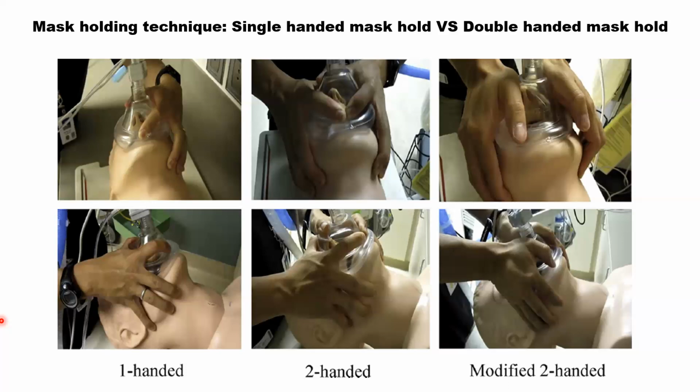For example, if you don't do the airway opening, you will see there's no chest expansion, even though you are making a good seal. So now you do a good airway maneuver. You have to lift up like that nicely. Okay.